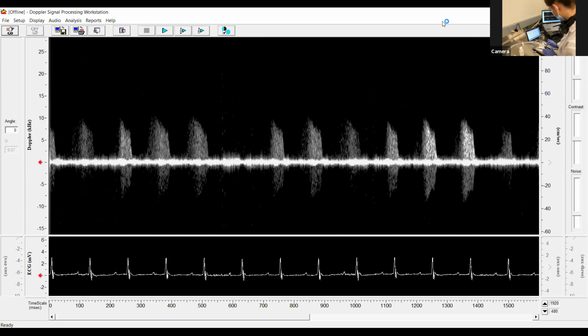Okay, I'm just going to pause that for us. Perfect. This is very characteristic flow. What we're looking at is a nice strong spike and then the signal coming down here. It would be the peak velocity that we'd be looking at to do that coronary flow reserve. Again, the micropositioner that we'll show you later would hold that stably in place throughout the imaging.